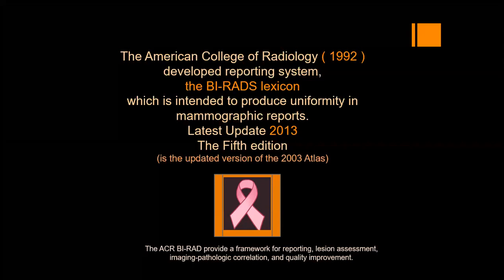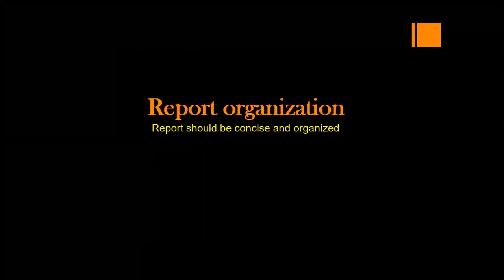The ACR BI-RADS provides the framework for reporting, lesion assessment, imaging, pathologic correlation, and quality improvement. And it's recommended to use it.